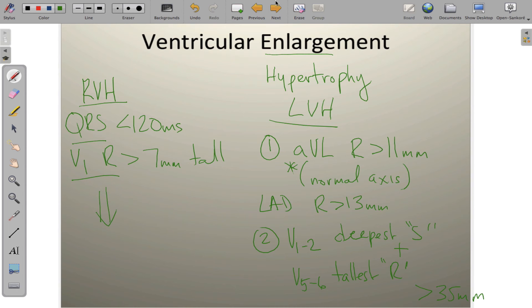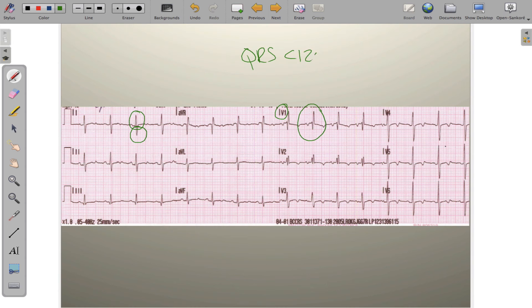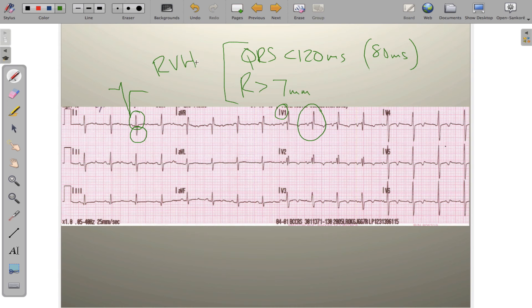Let's apply these rules to an EKG tracing. Right away, most leads show R and S waves that are pretty similar in size. Going to lead V1, the QRS complex is of normal duration — about 80 milliseconds, less than 120. Normally in V1 you'd expect a small R wave and deep S, but here there's a really prominent R wave exceeding about 7 millimeters. Normal-duration QRS plus R wave greater than 7 millimeters — we should be thinking right ventricular hypertrophy.